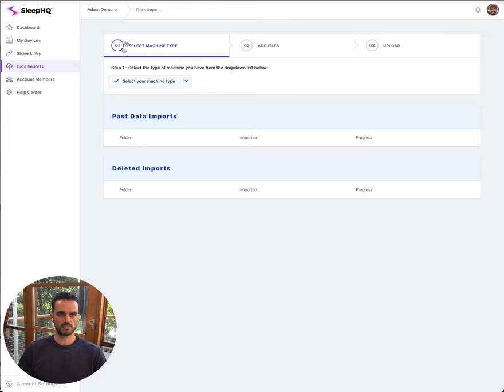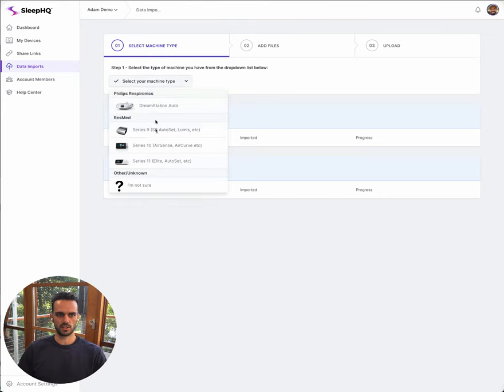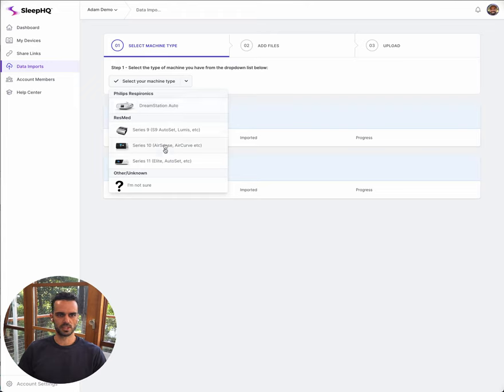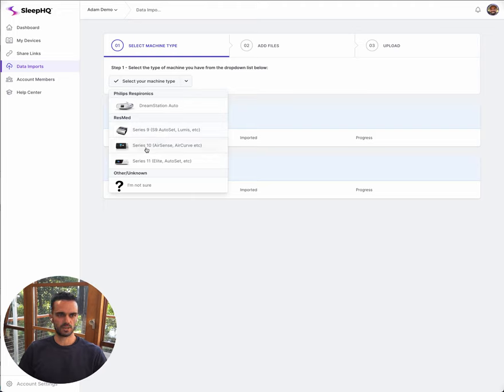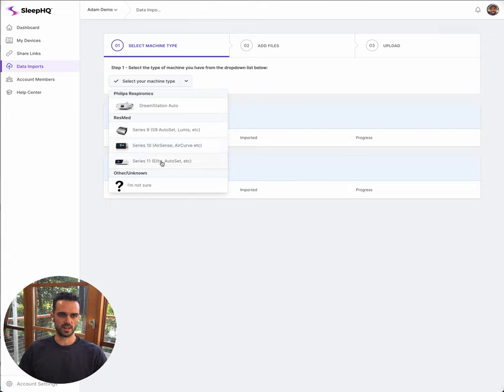The first thing I need to do is select my machine type. We've got a little drop down here that's going to show all of the machines that we currently support. At the moment that's the Philips DreamStation and a couple of the ResMed machines. ResMed Series 10 is any of the ResMed 10 machines, like an AirSense 10 or an AirCurve 10. If you've got an AirSense 11, then you would select a Series 11 machine.